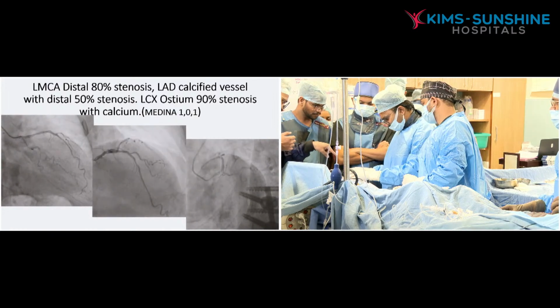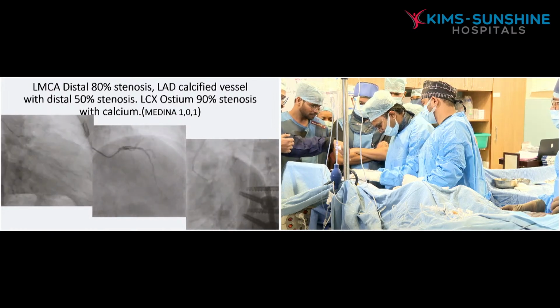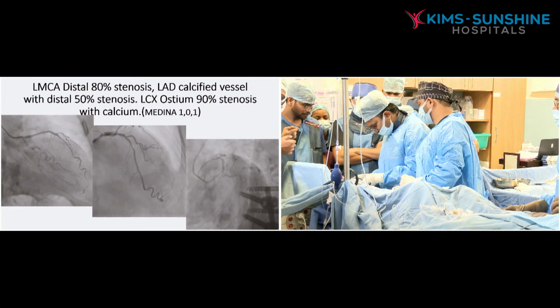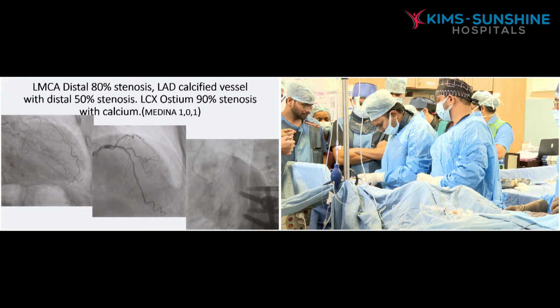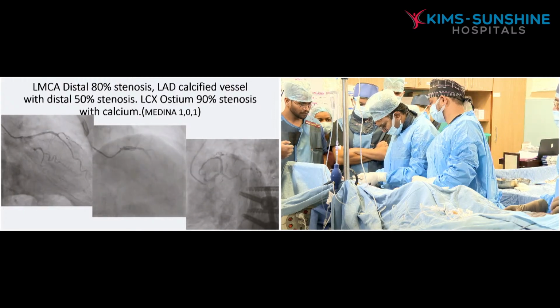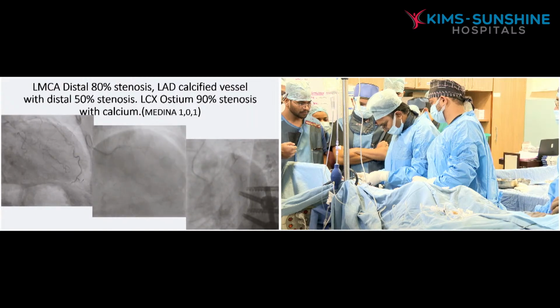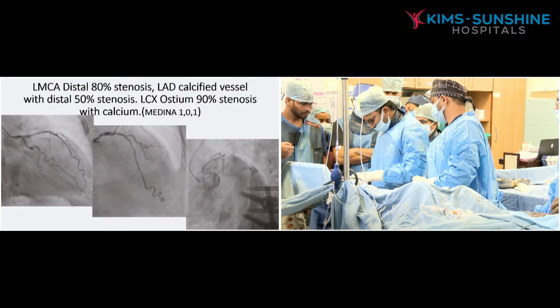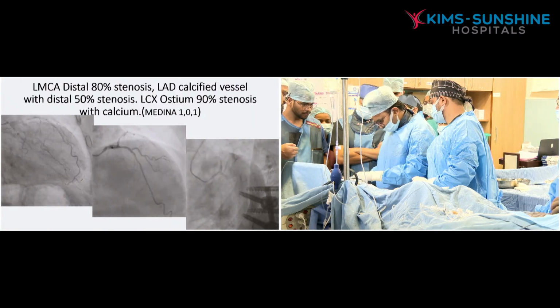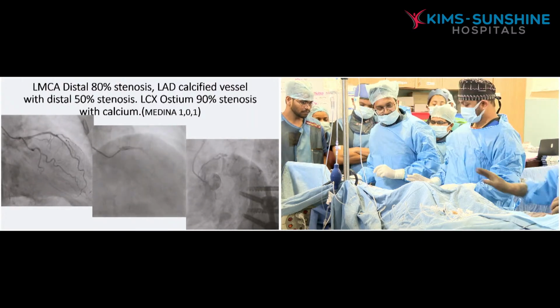Wire actually should be very minimal. Pull the wire. Pull the wire, sir. Hold it. Only the tip. Hold. Come. Wire should be at the edge of that, so that the wire will not. Defeat the wire and plug into that. Now you plug it, sir. Brake defeat button and plug it. Yes, perfect. Hold. Then that is fine.